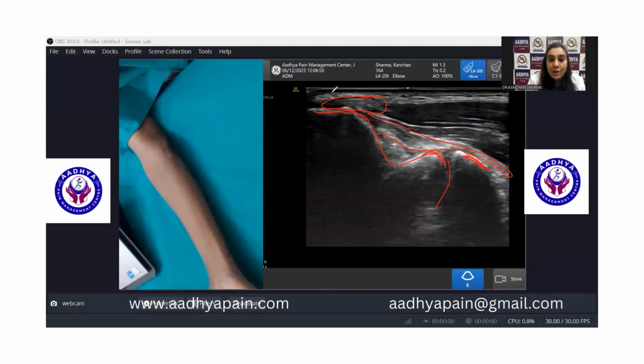But you need to look for a good amount of the tendinous portion in order to comment on the various aspects of tendinopathy. So what you need to do now is rotate the caudal end of your probe and bring it to a point where your probe is in line with the index finger of your palm.